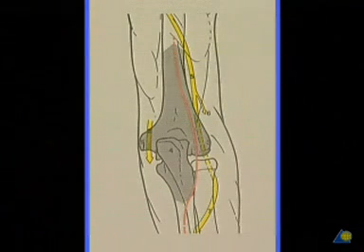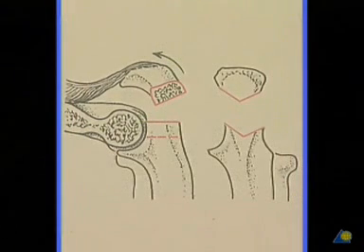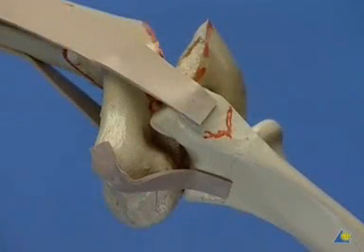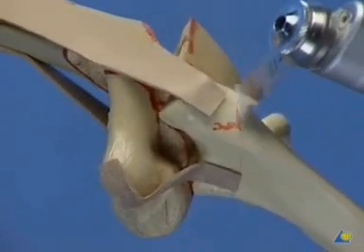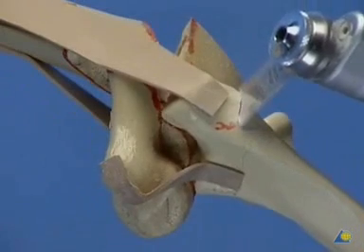To get good exposure of the articular fragments and to judge their accurate reduction, it is essential to perform an osteotomy of the olecranon during the whole triceps muscle attachment proximally. A chevron osteotomy is preferred to a transverse cut, facilitating reconstruction by tension band wiring. Using the oscillating saw, only four-fifths of the bone are cut; the final bit is broken off with a chisel and the olecranon is reflected proximally.